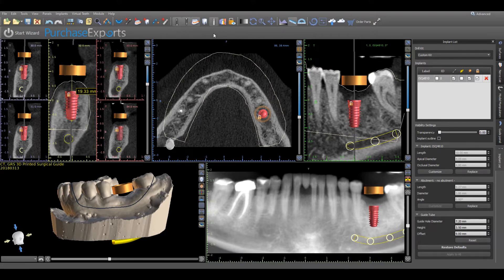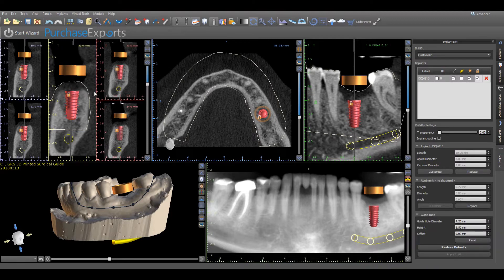If the measurement needs to be removed for any reason, simply deactivate the measurement tool, place the cursor on the display box and right-click the mouse button, and then left-click Remove when displayed.